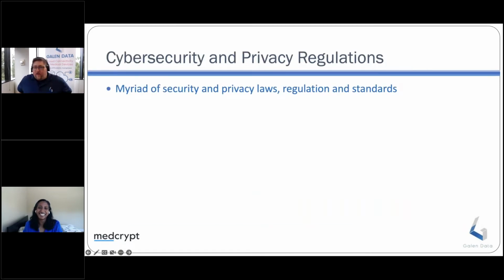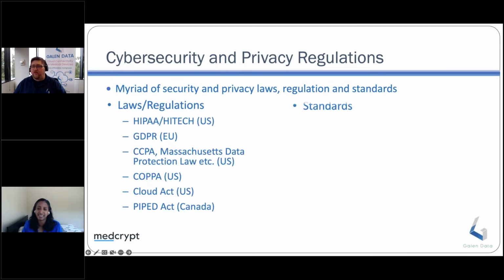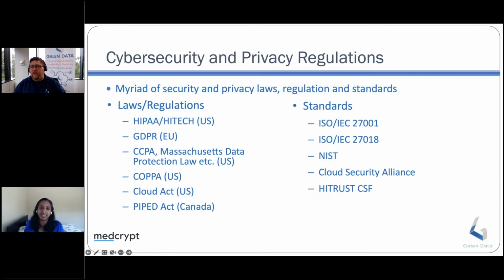So some of the security and privacy regulations, just as a review, I'm sure everybody on our call is well aware of everything that's out there. Things like HIPAA, HITECH, GDPR, the Cloud Act in the US. A lot of our states in the US are also enacting their own laws. California has a very extensive privacy law now that is also much more strict than things like HIPAA.